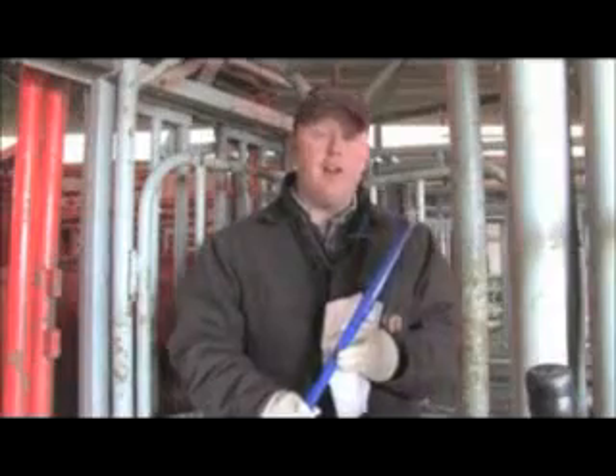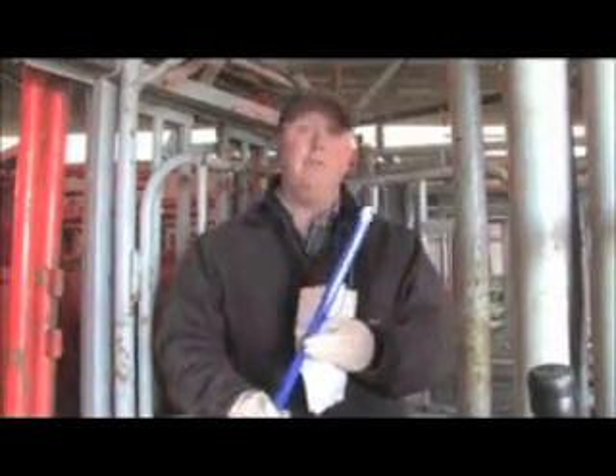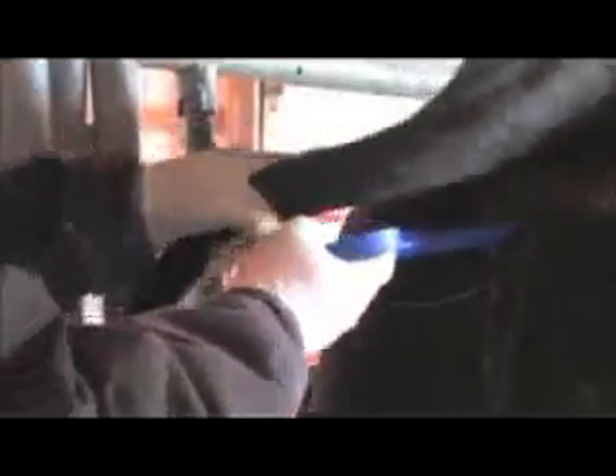Now that we have the CIDR loaded into the CIDR applicator, we'll demonstrate how to properly insert the CIDR into the cow. To insert the CIDR, approach the cow with caution and clean her vulva with paper towels to avoid dragging any fecal contamination into the vagina. Once the vulva is cleaned, spread the vulva lips with one hand and insert the CIDR and applicator at an upward angle, ensuring that the tail of the CIDR is pointed down. Insert the applicator until resistance is felt, then depress the applicator trigger and slowly pull the applicator back out. Ensure that the tail of the CIDR is facing down to minimize the chances of the CIDR being pulled out during the estrus synchronization protocol.